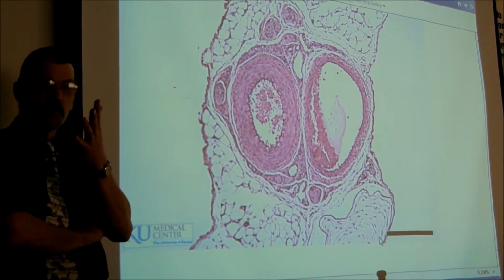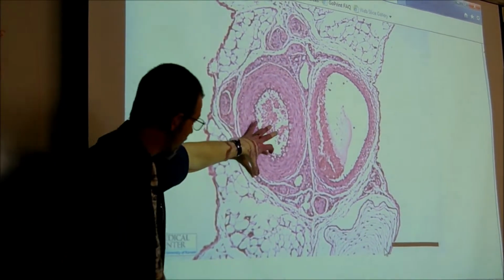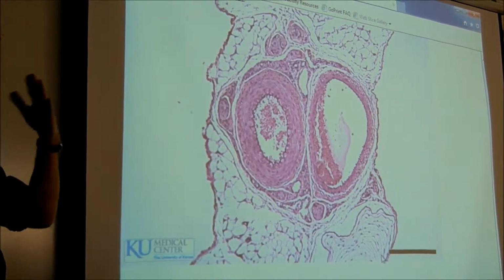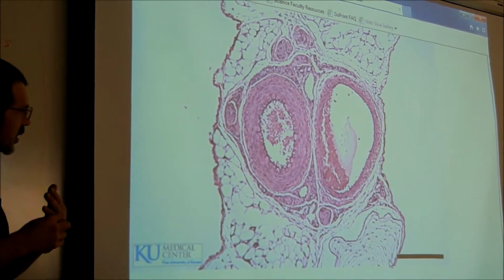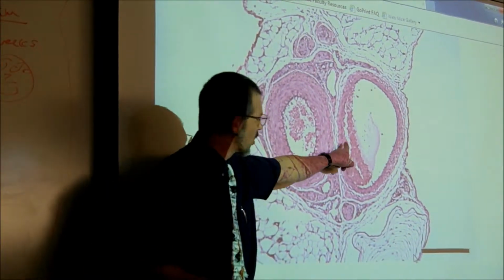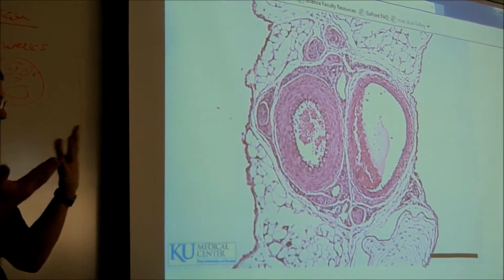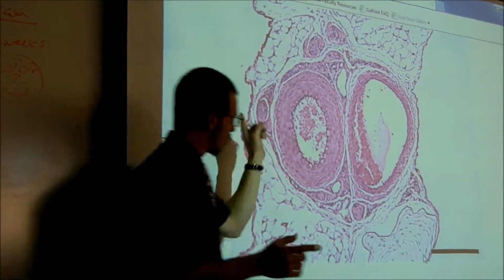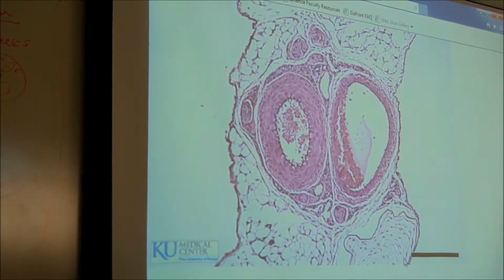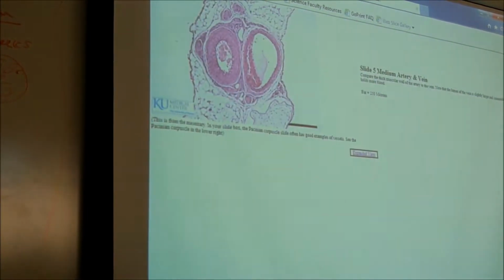Very good. So if you remember lecture, arteries are thicker walled because they have pressure, right? So the pressure, thicker wall like a fire hose versus garden hose. They're usually more rounded, but that's not always the rule, right? So the main thing you want to look for is the thickness. Veins are usually thinner. There's less pressure. They tend to be more kind of a blobby shape, not a round shape, not always. So your first question is, an artery or vein? So the artery is on the left, veins on the right. So look for layers, the size of the layers, basically.